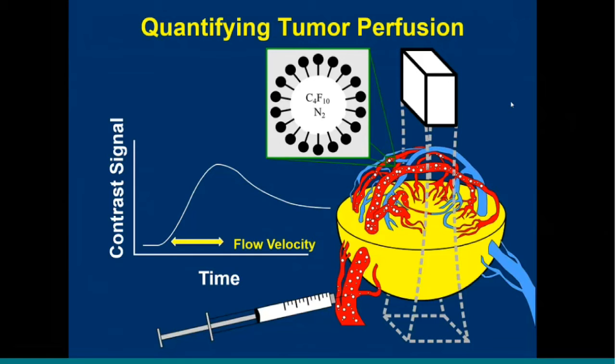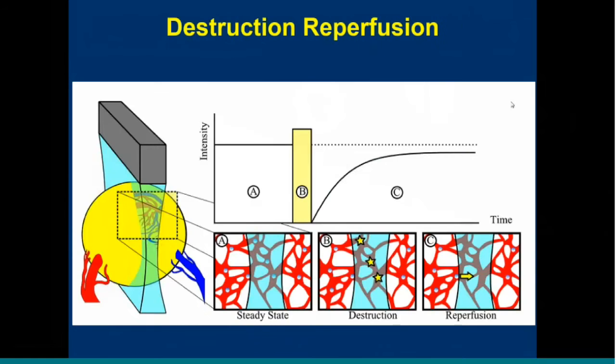And those injections are quite difficult. It's basically impossible to coordinate the injection of the contrast agent into this very fine capillary network of the CAM with keeping the transducer fixed above the center of the tumor. So bolus contrast imaging really is impossible, at least not in as far as we've been able to do it. So instead, we've been relying on destruction reperfusion imaging.